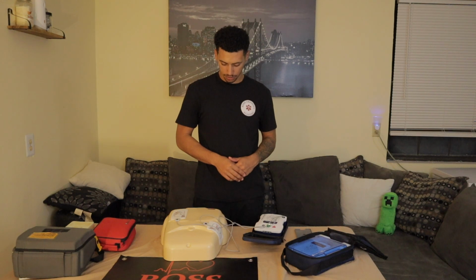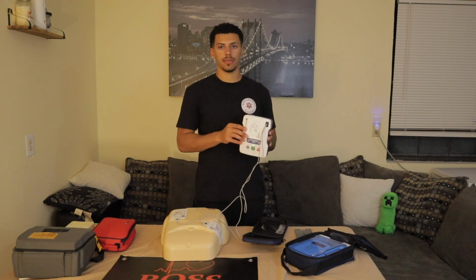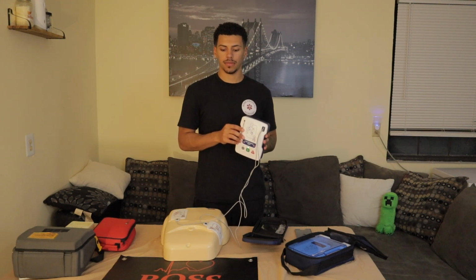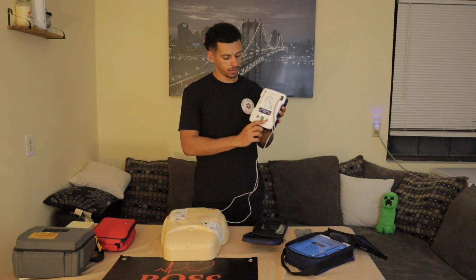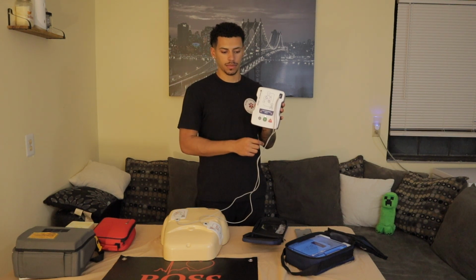Do not touch the patient. Analyzing heart rhythm. Do not touch the patient. Analyzing heart rhythm. Shock advised. Do not touch the patient. Everyone clear. Press the flashing shock button. Press. Shock delivered. Begin CPR.